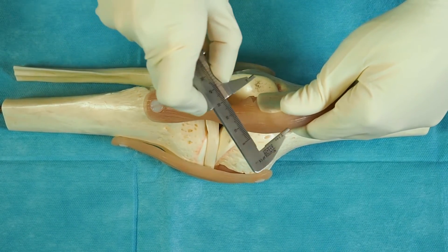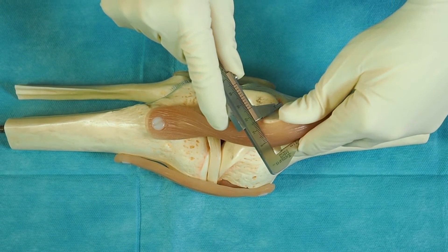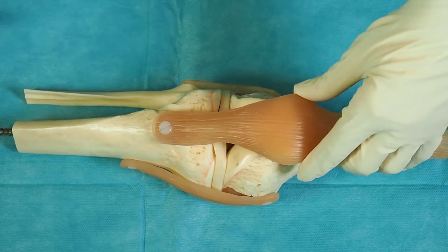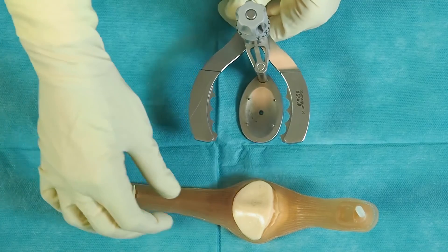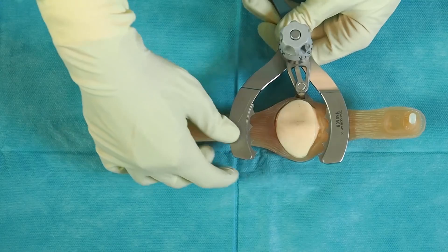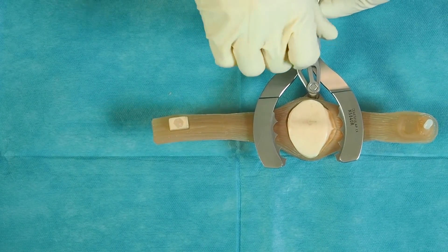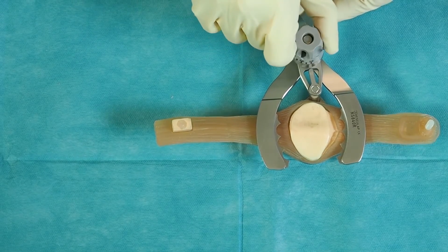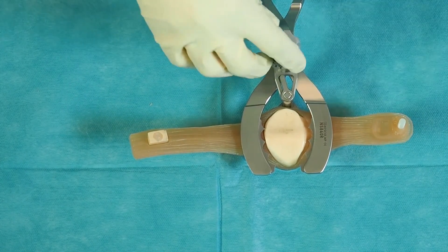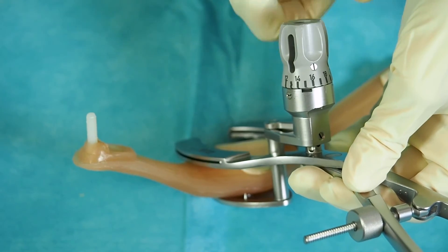The thickness of the patella is measured using the caliper. This thickness should not be exceeded after implantation of the patella implant. The level of bone resection is calculated. A minimum thickness of the remaining patella bone should not be less than 12 mm. The patella is fixed into the patella resection clamp. The resection level is adjusted by turning the resection depth wheel to the planned level of remaining patella bone thickness.